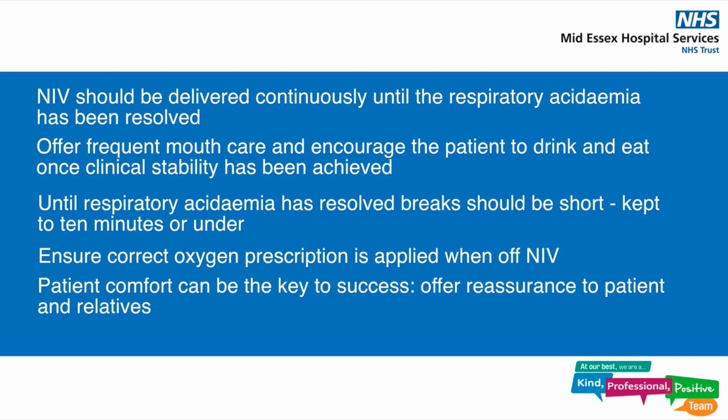Patient comfort can be the key to success. Offer reassurance to the patient and relatives. Always ensure call bell is within reach.